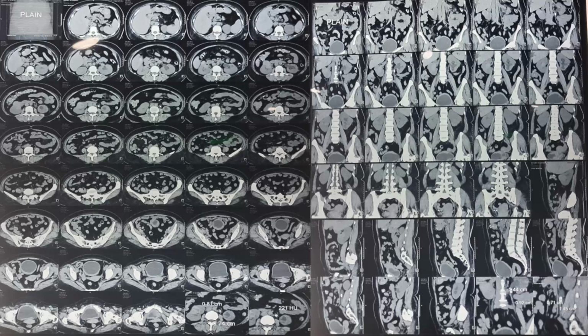Okay. Who is going to read this? Mokani, will you like to attempt? Yes, I will attempt, sir. So the first one is the axial section, plain CT scan of the abdomen, axial section.